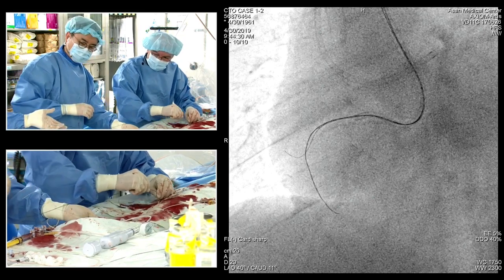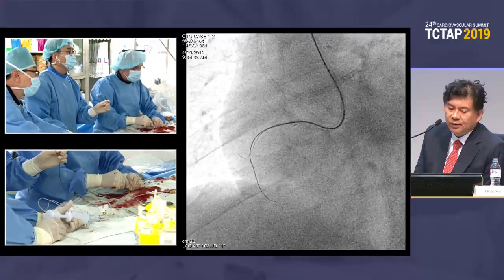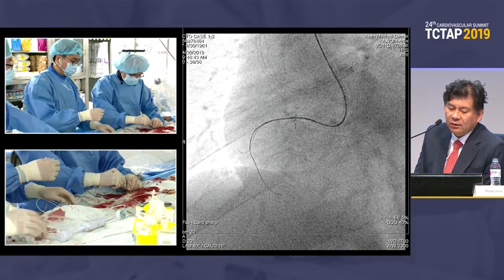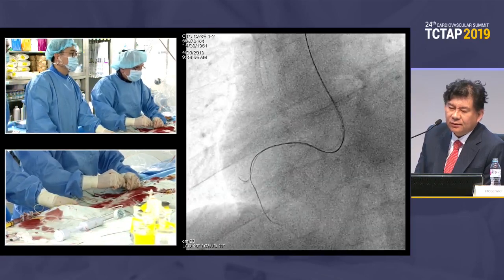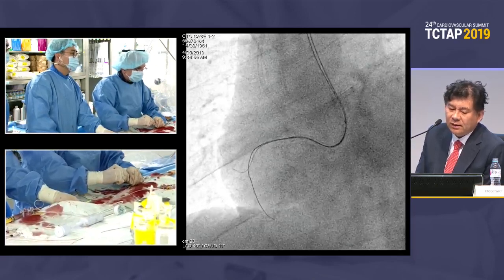For the real-time IVUS guided wiring, do you still prefer 7 French guiding instead of 8 French? No. Sorry, I didn't get that. You used the Finecross because of the real-time IVUS guide. Yeah. The 7 French will not accept a bigger microcatheter. Yes. So some operators prefer to use the 8 French guiding for the real-time, because once you're crossing the wire, the microcatheter support with the Finecross may be limited.